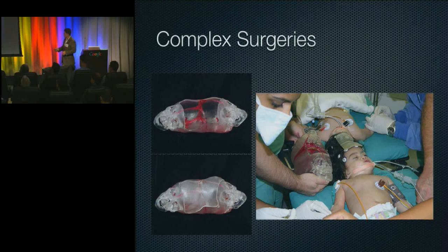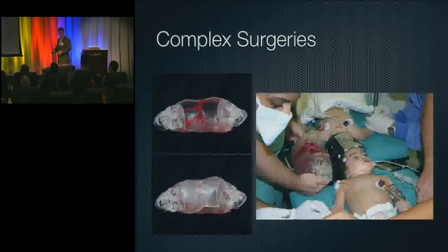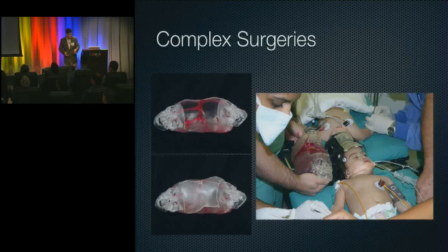And in these cases, they'd use these physical models to take a very complex procedure and bring it down to a level that the whole surgical team, which could be 20 or 30 or 50 people, could understand. This makes these procedures time efficient in the best way they can, taking a procedure that might be 100 hours and trying to turn it into 50 hours, but also trying to save lives.